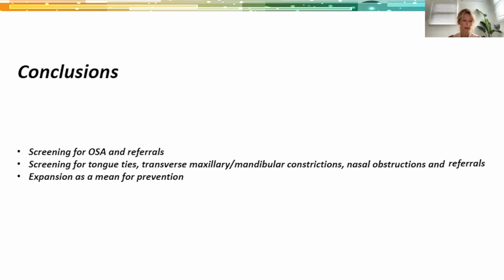And the part that we can control right away is the angulation of the implants, so we can plan them that way to allow for a wider arch for the future restoration. And these are just a couple of examples of how we have a smaller maxillary size, but then the arch is restored much wider, much bigger with attention to airway. These slides, these patients are courtesy of Dr. Mikalakis, who is our professor and chair of our department.